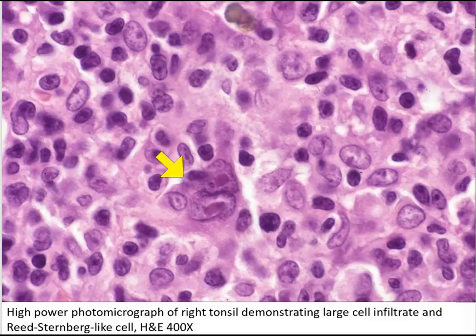Here is another Reed-Sternberg-like cell in infectious mononucleosis. The lesson here is that just because you see cells that look like Reed-Sternberg cells does not make it Hodgkin lymphoma. EBV infection can transform a B cell to adopt the morphology of a Reed-Sternberg cell. We only call it a Hodgkin Reed-Sternberg cell and diagnose classical Hodgkin lymphoma when there is an appropriate inflammatory background of reactive lymphocytes, eosinophils, neutrophils, histiocytes, and plasma cells.